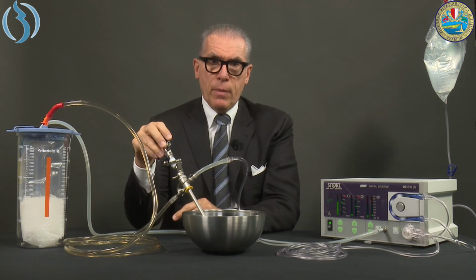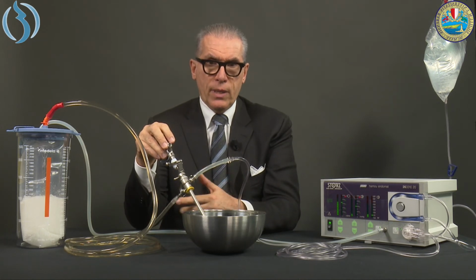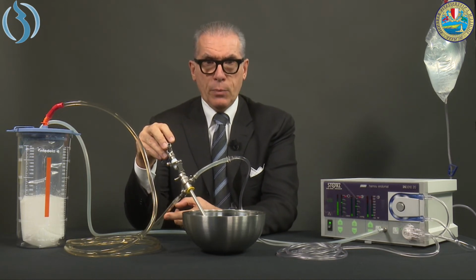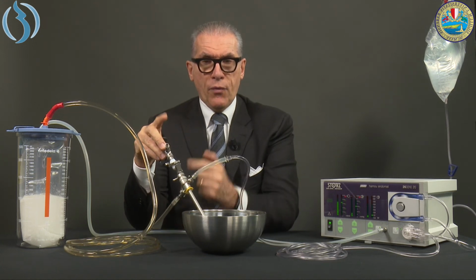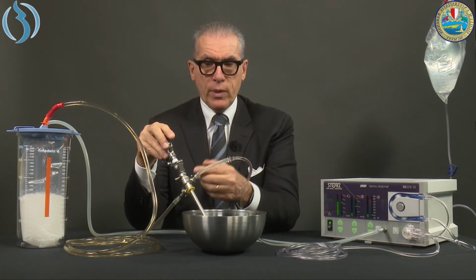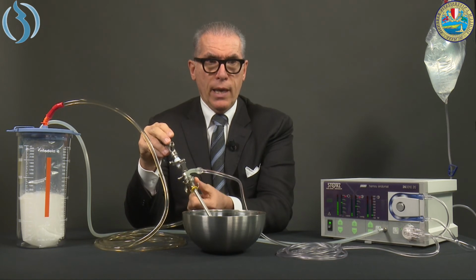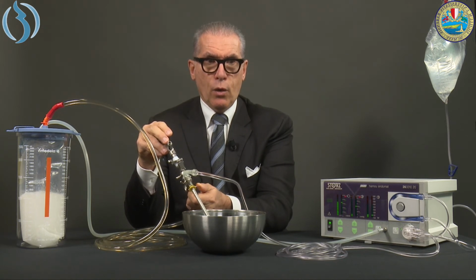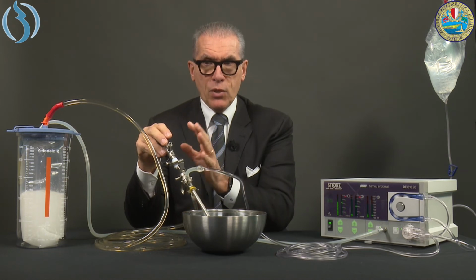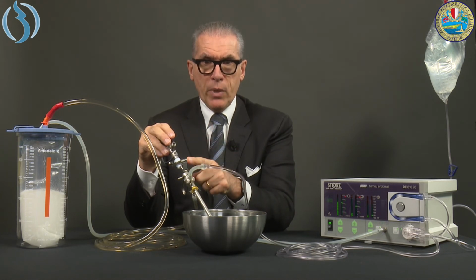One recommendation: some colleagues do not connect the aspiration and work only with the irrigation. This is nonsense from my point of view, because by not connecting the aspiration to the system, you lose the feedback between inflow and outflow, and therefore you will not be able to control the intrauterine pressure. They play with a stopcock located here, opening and closing it as a kind of manual regulation of the aspiration. I think this is not a proper way to do it. You have to keep the machine as it has been designed, with the inflow and the outflow connected with the good parameters.